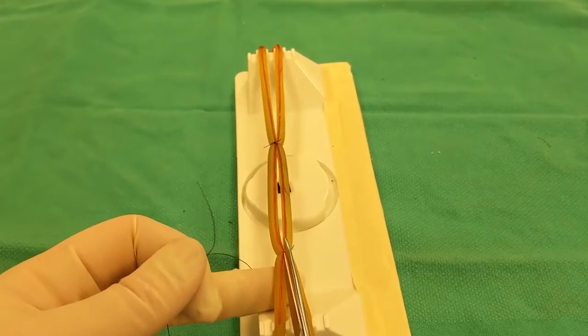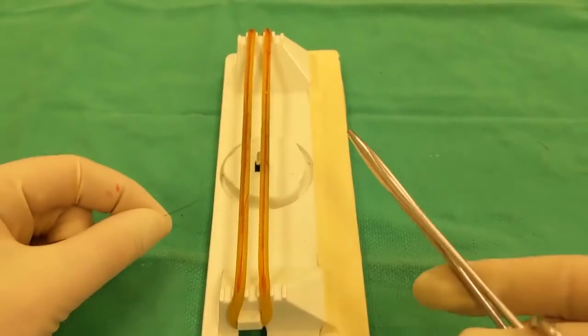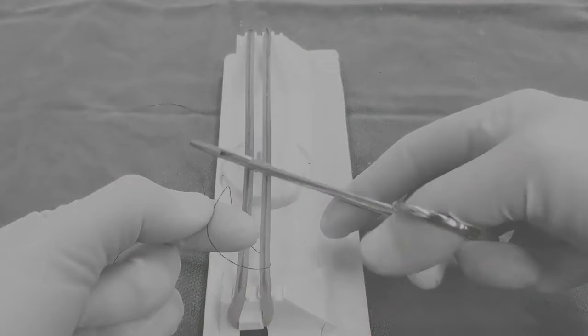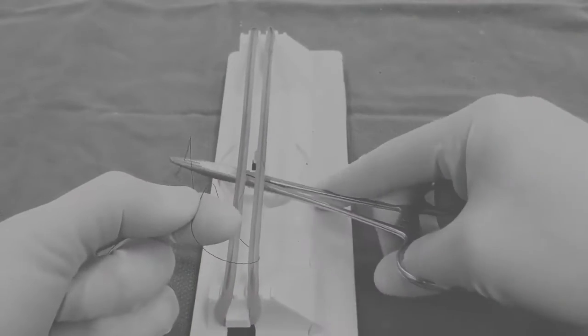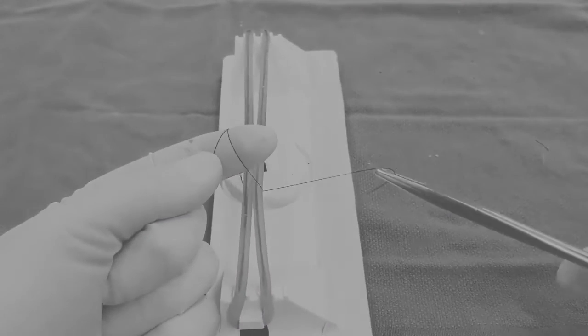Now we'll move on to friction knots, which provide the most secure ligation when performed correctly. Friction knots wrap around the pedicle twice before knot formation, which dramatically increases the friction between strands and improves ligature security.